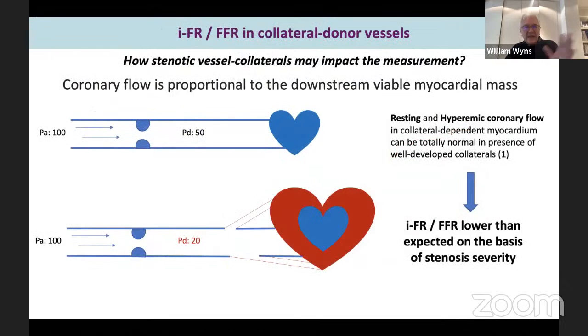A bit along the same lines, but different context, it's the typical situation of the occluded right, chronic coronary occlusion, and a mild stenosis on the LAD. And the question comes very often, okay, do we treat the LAD or not? Mattia, tell us how to react to that clinical situation.